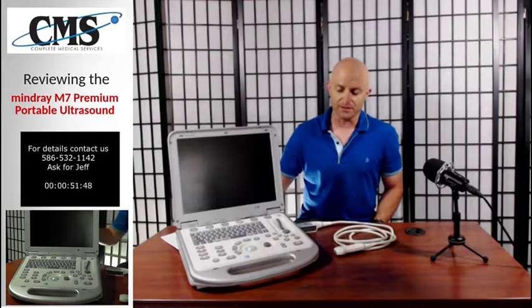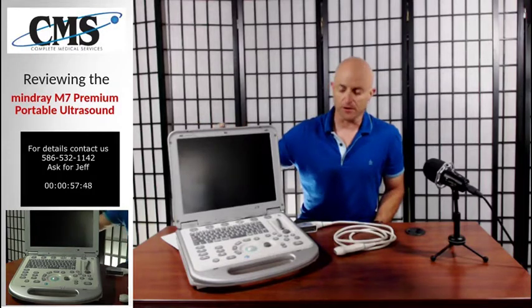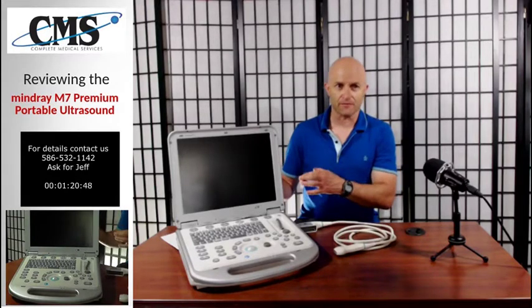This is a great portable ultrasound system with a very good monitor — a 15-inch high resolution monitor. Before we get into the full specs, I did want to mention that the Mindray M7 actually comes in two different versions: the standard and the advanced. The advanced is fully shared service to include cardiac. The standard is all general imaging, except for cardiac.